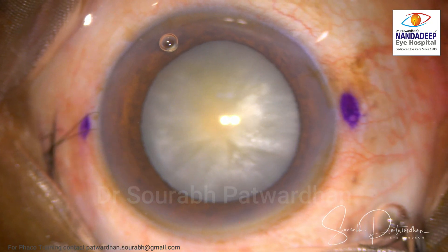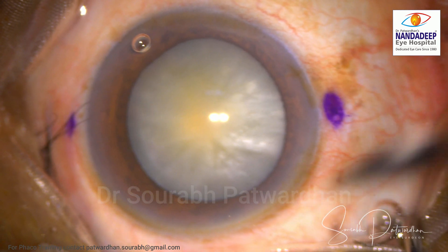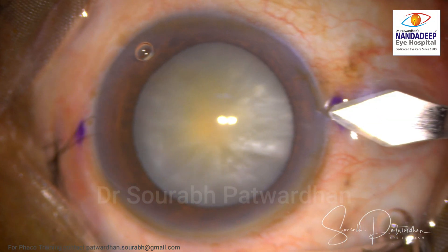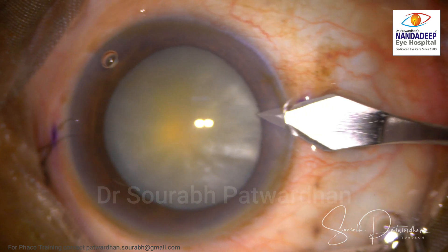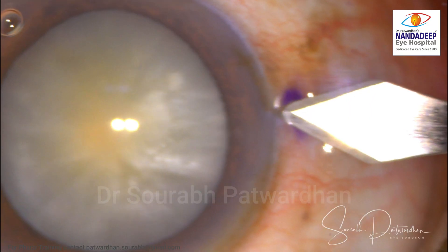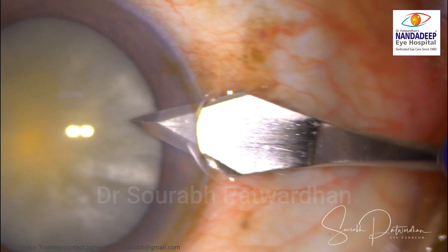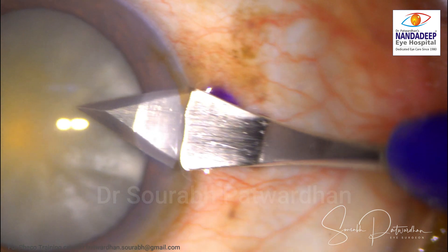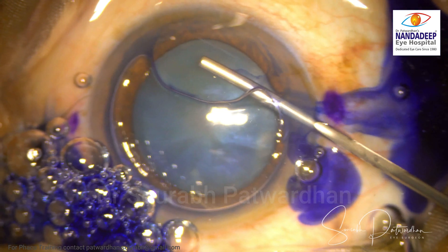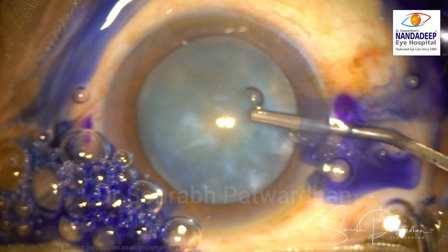This is a white mature cataract. I am going to do phaco emulsification in this surgery. I've done a side port incision, and this is the main 2.8 millimeter incision. You can see the incision is perfectly rectangular — no ragged edges, no short incision. It's around 1.5 millimeter or more long, and full pass of the keratome indicating a full 2.8 millimeter wide incision.